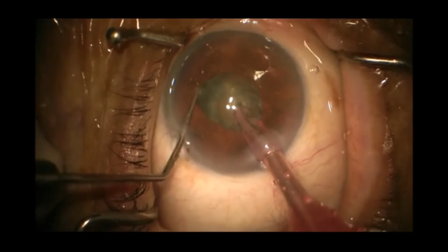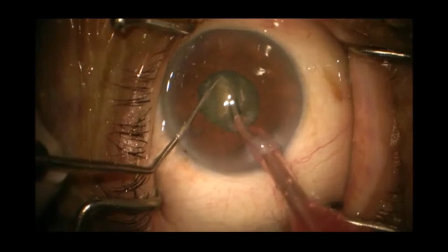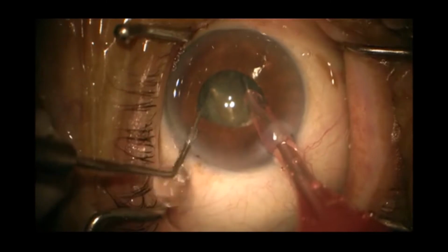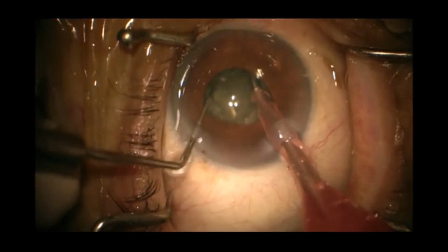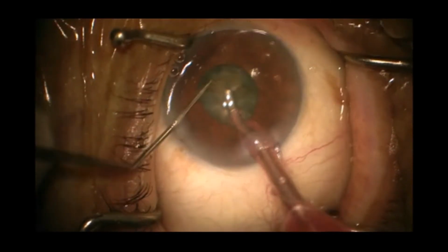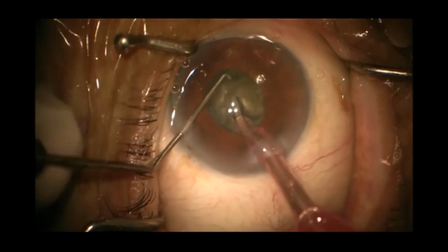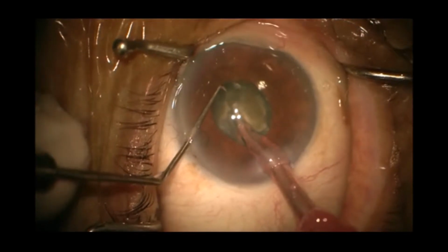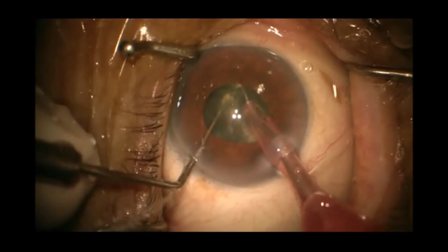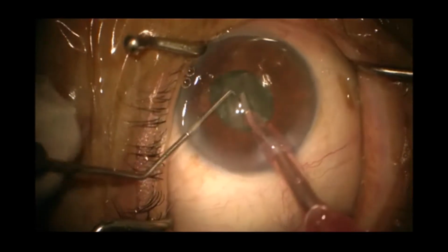Now I bury my phaco tip down, go all the way from the periphery to the center and create the first crack. It is not a complete crack, so I bury again, try to separate. Again we achieve the crack but not from one end to the other. Again find a deeper nuclear plane and try to achieve a crack, initiate the crack again.